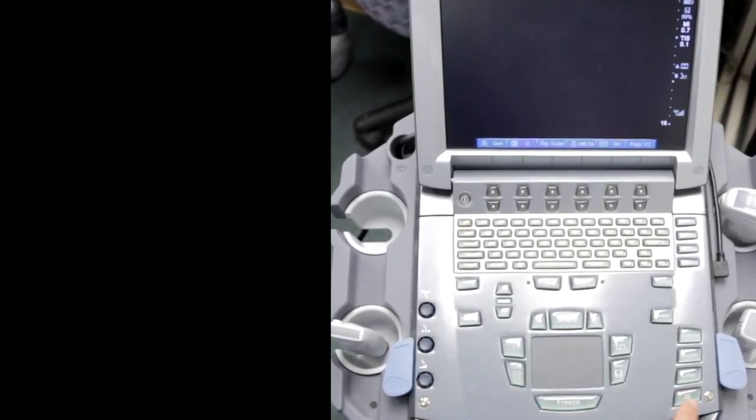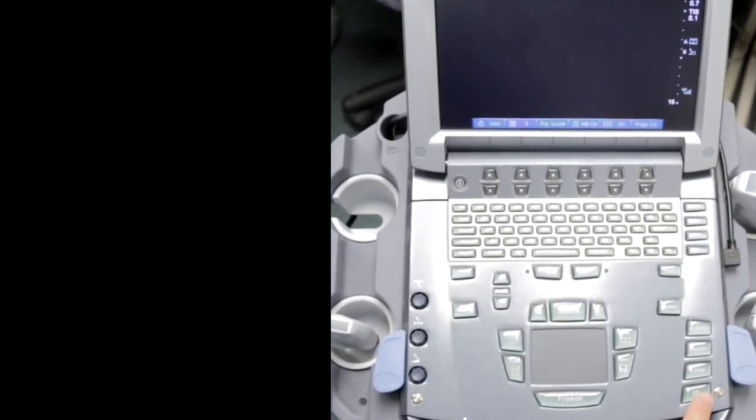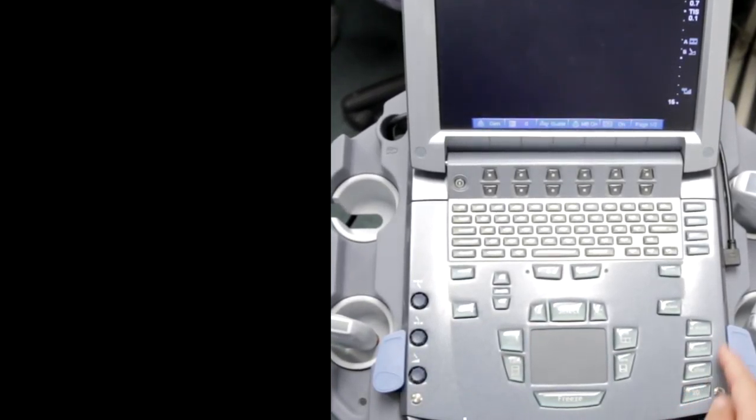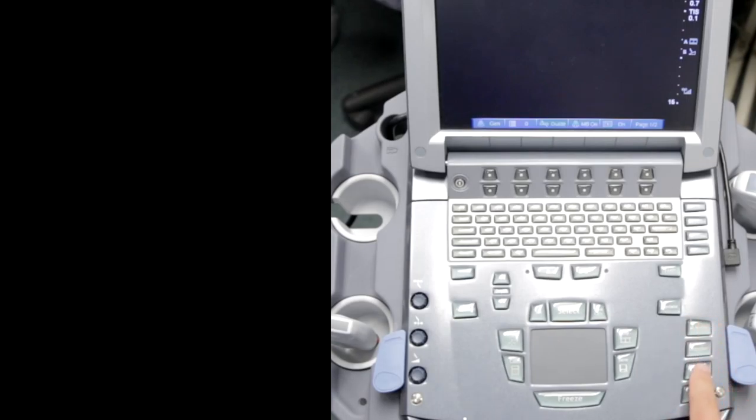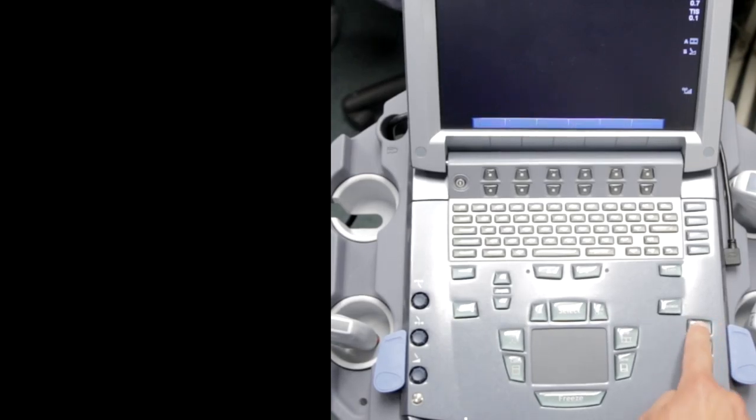Here are your different modes. Normal is 2D mode, that's where you're going to be. If you want to use M-mode, this is your M-mode, and this is your color over here.